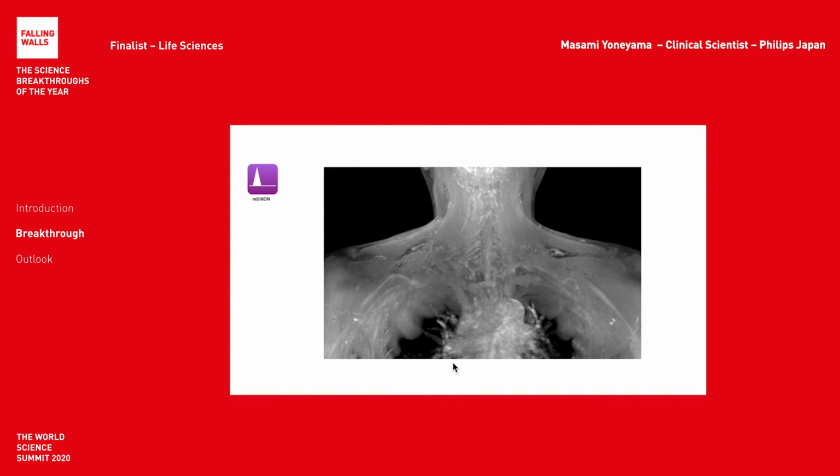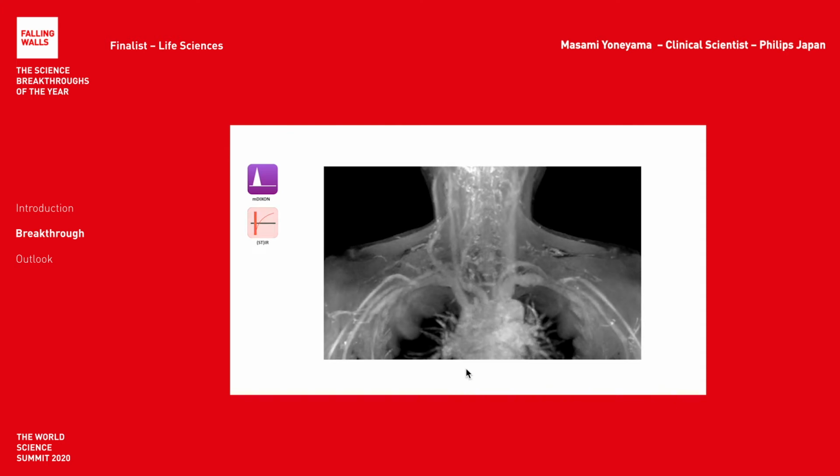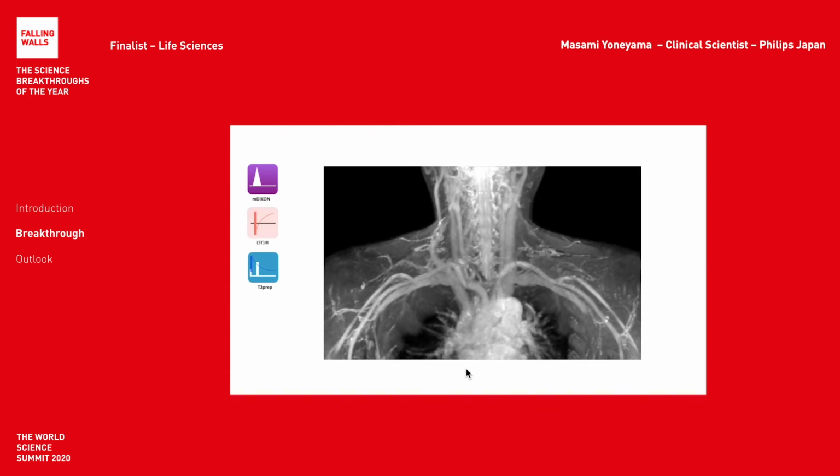In addition, during signal reception, we acquire two MR echoes to separate the signal from water and fat. In this way, when we look at the water images, no fat is present, no signal from other background tissues like muscles and organs is visible, and only blood vessels are shown in the final image. It is a nice way to scan the body vasculature. You can apply it almost anywhere in the body, from neck to toe.